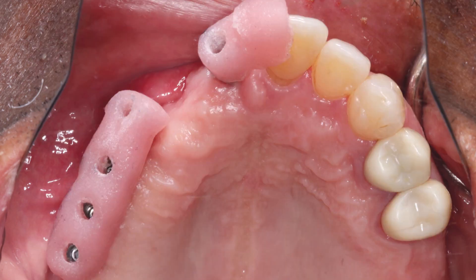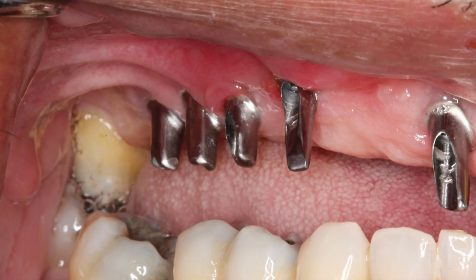The laboratory fabricated inclusive custom abutments with gingival or slightly subgingival margins. The abutments were delivered using the lab-created seating jigs to ensure proper orientation and the prosthetic screws were tightened to 35 Newton centimeters. Proper torque is critical to preventing abutment loosening over time.